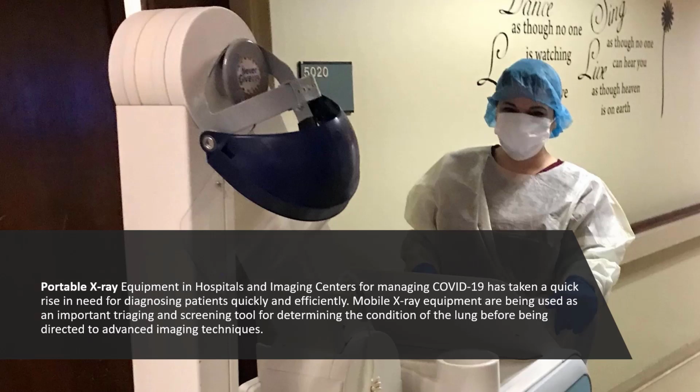Interestingly enough, we're also doing more portable examinations today than we used to do in the past. Because of the possibility of COVID infection, we're going to take a chest examination or a quick look at the chest x-rays of patients that possibly have COVID prior to bringing them down to the medical imaging department to do other studies on medical imaging equipment. So, the portable becomes the first guard in making sure that we're not spreading disease and infection among medical imaging colleagues.